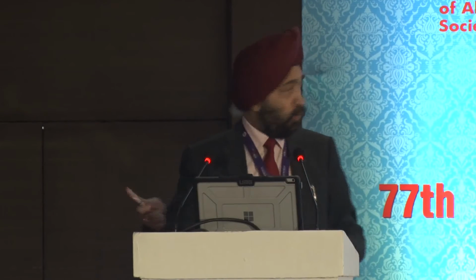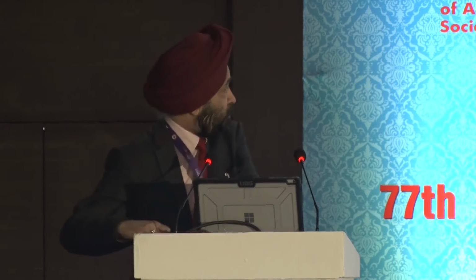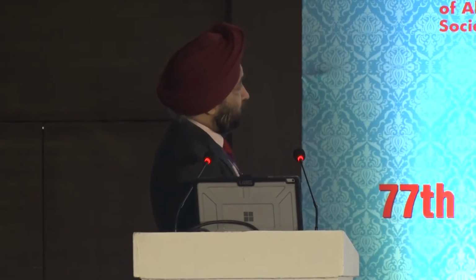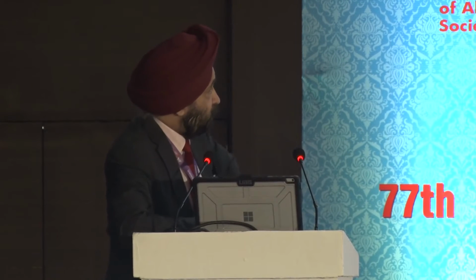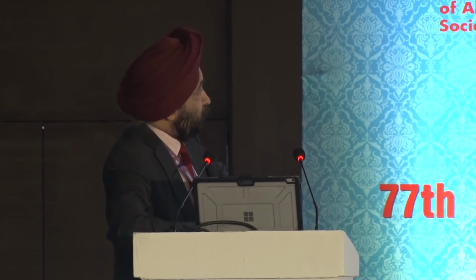Well, I'll be showing you certain situations which have been given to me. This is called the IOL scaffold. This is a femto procedure that we are doing, and you can see this is a polar cataract. It can be easily visualized. This is the fractionation of the nucleus that is happening. That was the capsulotomy image.